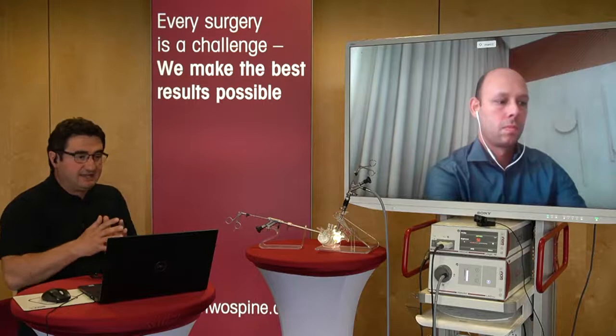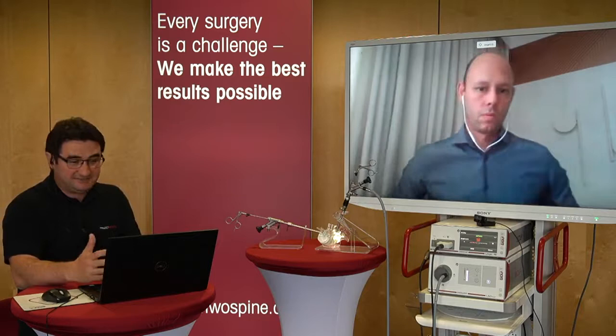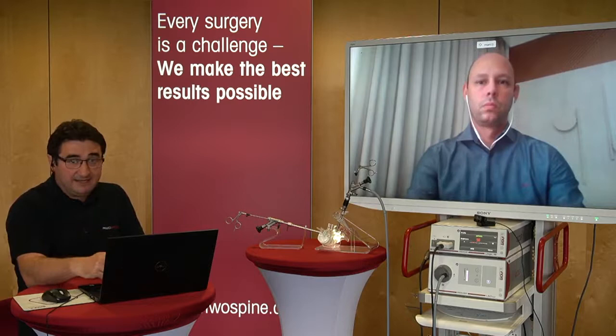And for example, when we started with Professor Jambola in Turkey, at the beginning of our learning curve, when we faced a dural tear for the first time, we immediately switched to open surgery, and we had a CSF leakage after the surgery, and a fistula. After that time, we never switched to open repair.